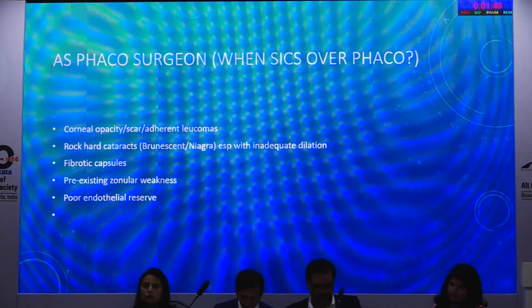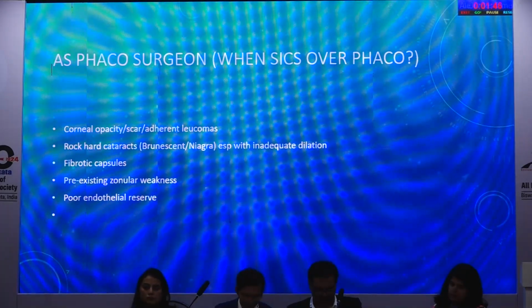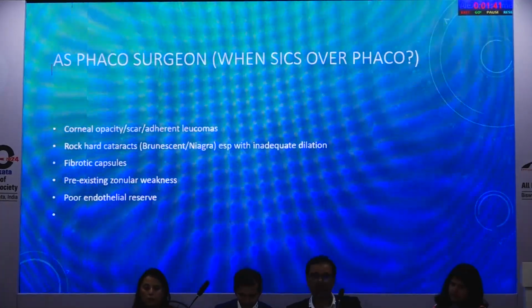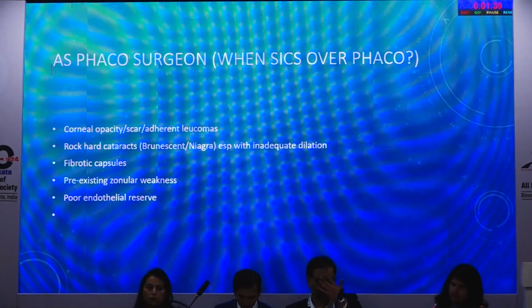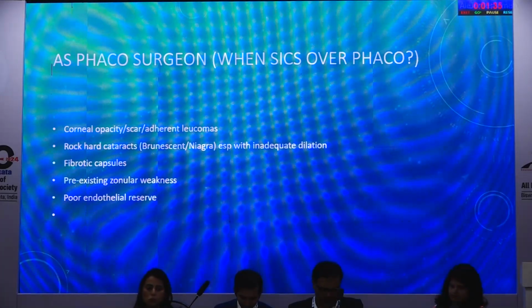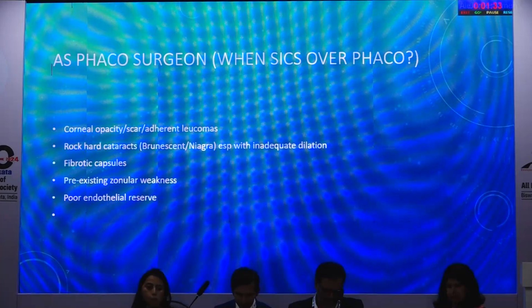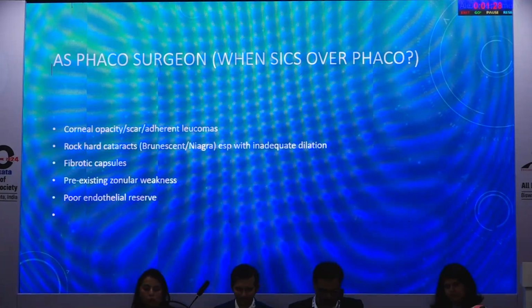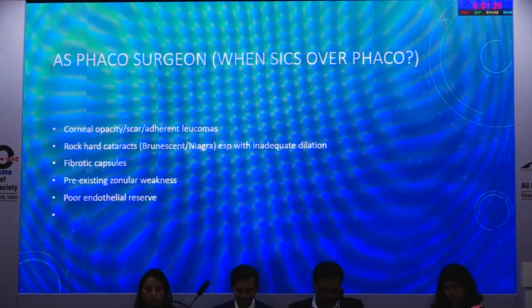If you're a phaco surgeon doing your phaco very confidently, why do you still need to know the art of SICS? In certain complicated situations of corneal opacity, scar, adherent leukomas, in very rock hard cataracts with poorly dilating pupil, fibrotic capsules, those having pre-existing zonular weaknesses, and poor endothelial reserve, these are the situations when you should plan for a primary SICS.